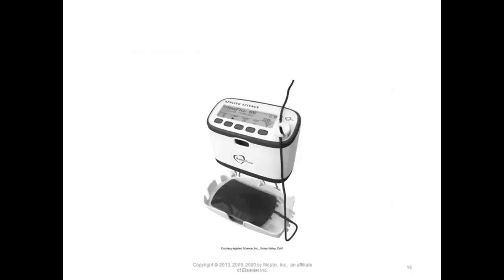As the blood is in the process of collection, you may see a device similar to this. Now, this one is a mechanical device. The donor tech will place the bag into that tray. Once the donation starts and the blood starts flowing, as the bag begins to fill, it's on a rocker, so it'll start rotating. You can see that this meter is digital, so when it gets to the volume size, let's say 500 mils, it'll stop.